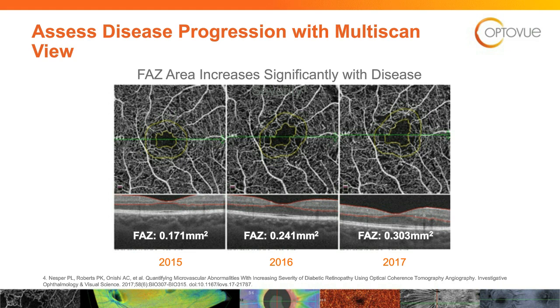Maybe instead of, again, how often do you see that patient with no retinopathy? Let's say their vision's relatively good, 20/20, 20/25, and they have no diabetic retinopathy. I'm guessing you're seeing that patient in a year. I would probably examine that patient in 6 months. I'd follow that patient more closely, maybe even 4 months, depending on the enlargement of the FAZ and how much capillary dropout it is. I would consider maybe a supplement in that patient.